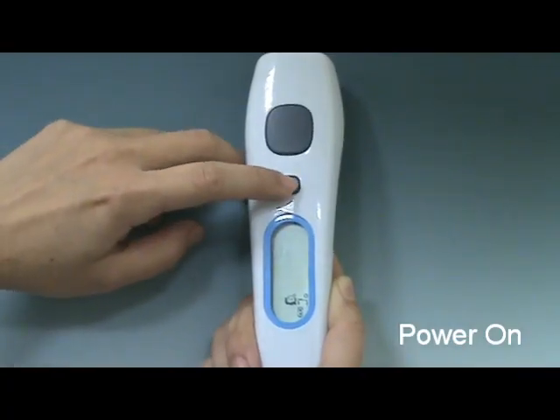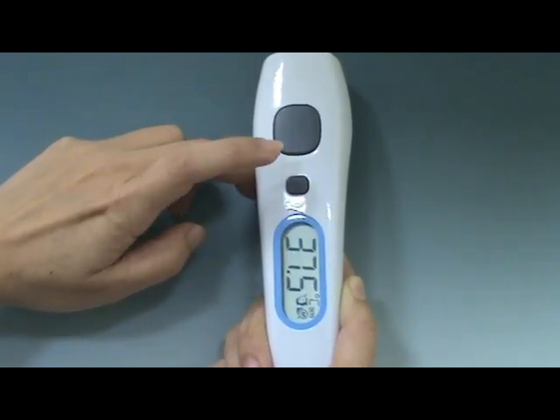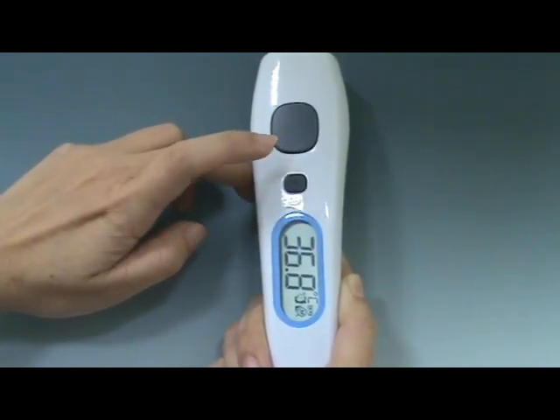After power on, press the main button to see the temperature records. There are a total of 25 sets of measurement records for forehead measurements.